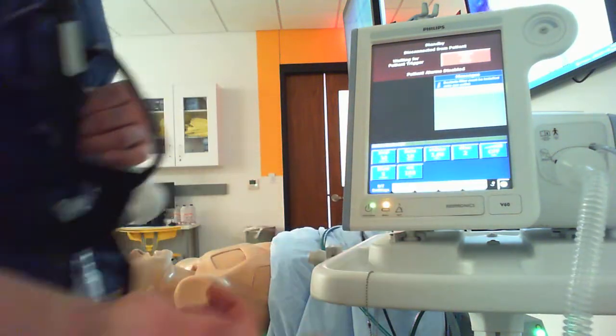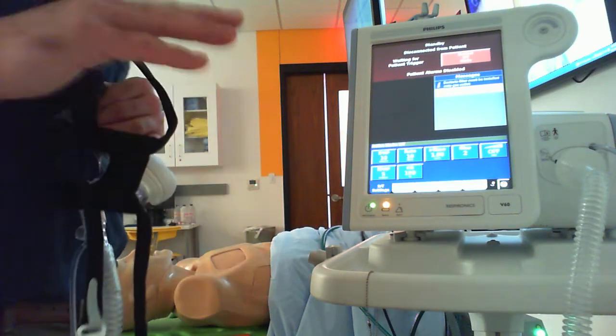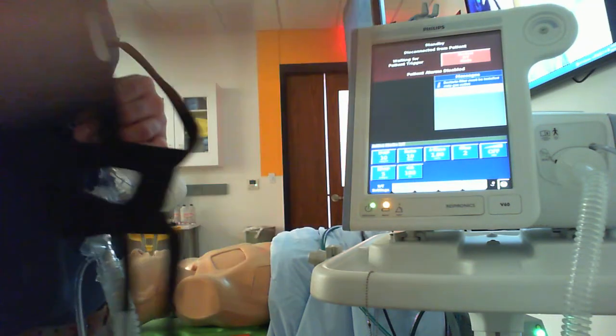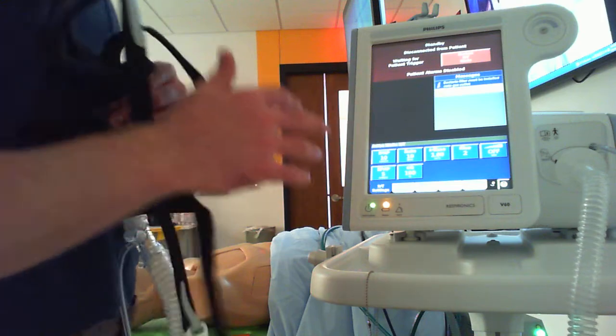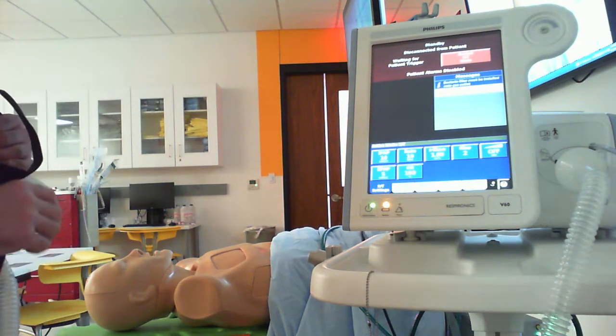Ramp, we don't really use in acute settings. Ramp is pertaining to the EPAP. If you had somebody with a really high baseline and you wanted to start them out low and work your way up, you could use that. Might be okay for sleep time maintenance, but for acute care issues, we usually don't set that.